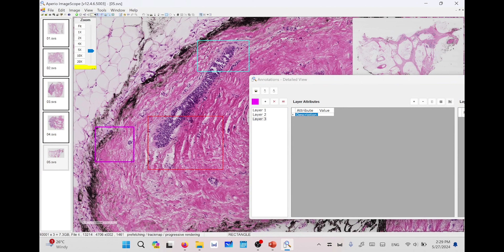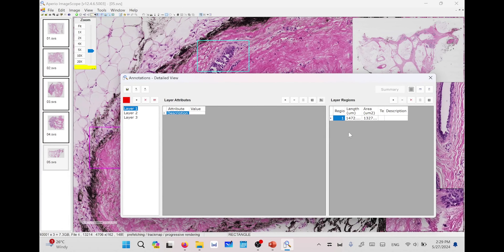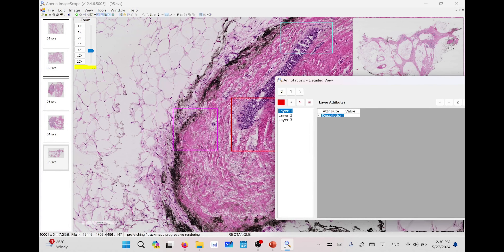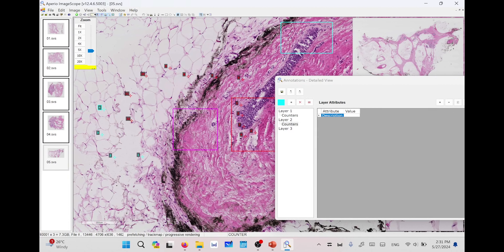For the first layer you will find the region with its length in micrometers and area in micrometers squared. You can type a description such as tumor, benign region, or malignant. You can also write text that can be used as classes or keywords for that region. The same applies to the second and third layers. If you go to the first layer and start counting, all points counted will be related to the highlighted layer, and similarly for the second layer.